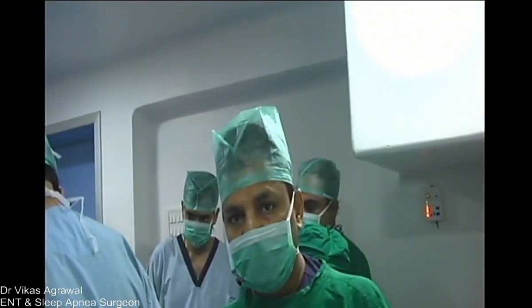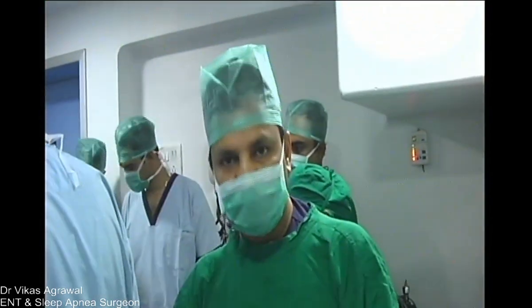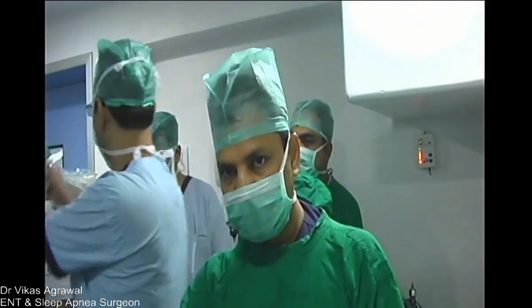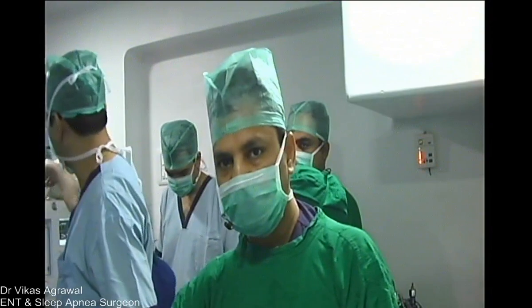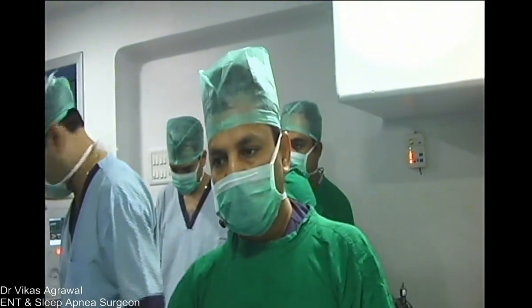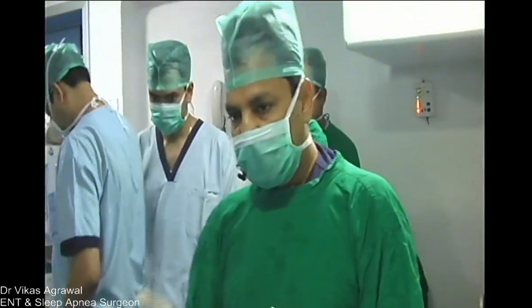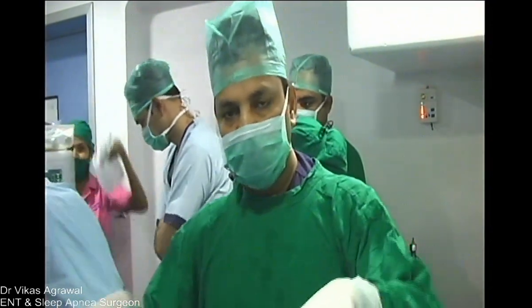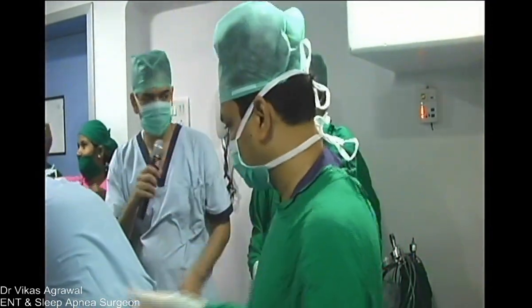So we should be taking the lowest lesion generally first. Like if we are doing the throat and the nose together, if you do the nose first, the problem is that the blood will keep trickling into the throat when you are operating. You pack the nose and then you'll have difficulty. So it's better to do the throat part first. So we'll do the uvulopalatopharyngoplasty.